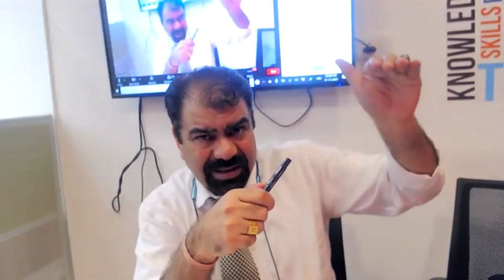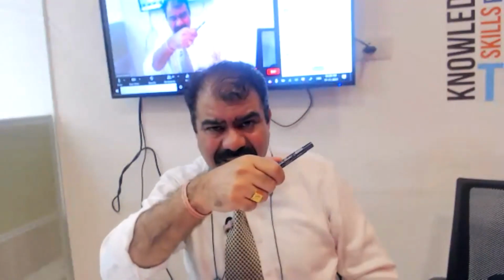And once I have the cervix, now after scanning the cervix, what I have to do? I have to now elevate the probe and insert it a bit deep. And once I got that slice from fundus and the body, what again I have to do to go to the cervix? I'm repeating now. What I have to do? I have to pull the probe, not completely out, slightly out, and I have to angle it posteriorly. This is the trick. So I hope that Dr. Tanya has got the answer to that question.